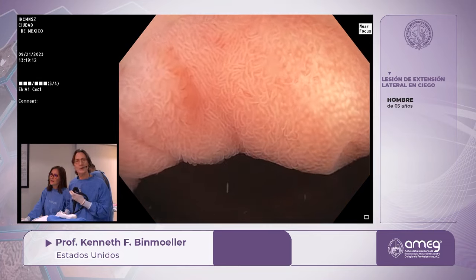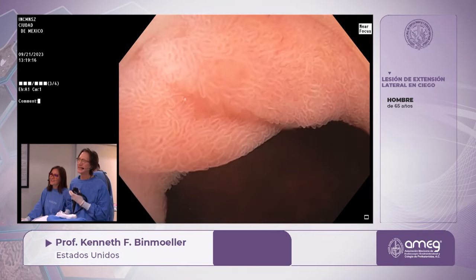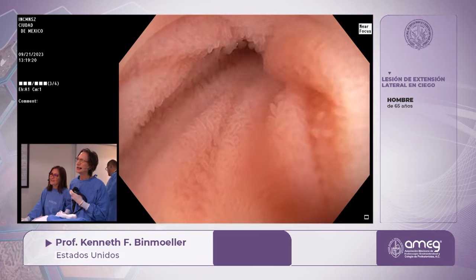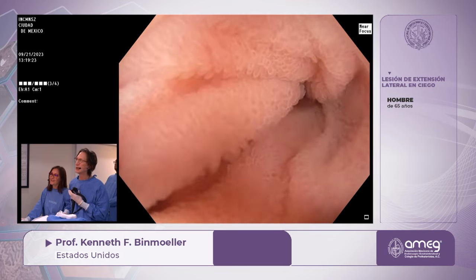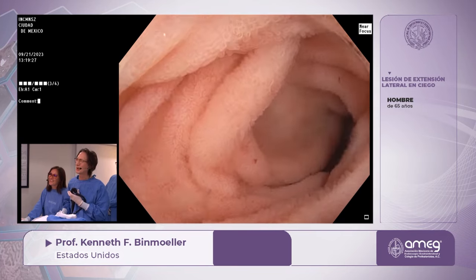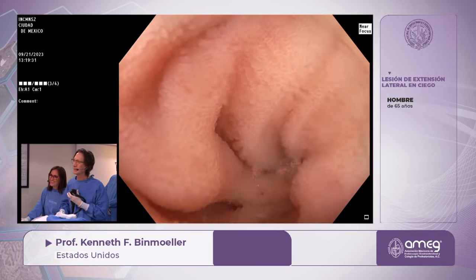And when you're underwater, everything floats towards you. So it's just the opposite when you use gas. So it's very easy to maneuver your way into the terminal ileum just by slowly pushing and letting the water float the boat. So I'm floating the boat up the river into the terminal ileum like this.